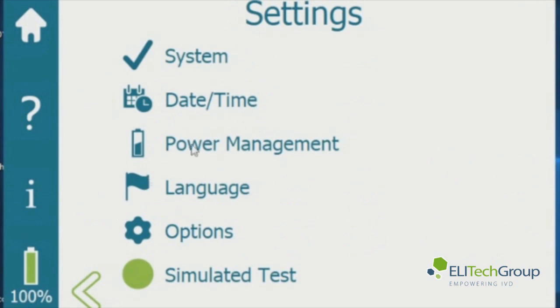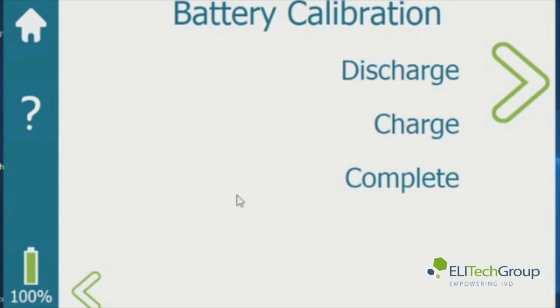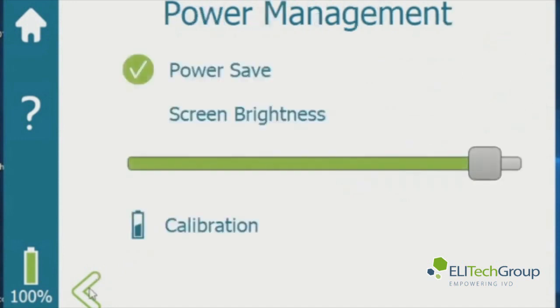Go to power management — this is where you can enable power save and adjust the screen brightness. You can also go to the calibration, which is where you calibrate your battery indicator. You may do this if the indicator doesn't seem accurate enough.